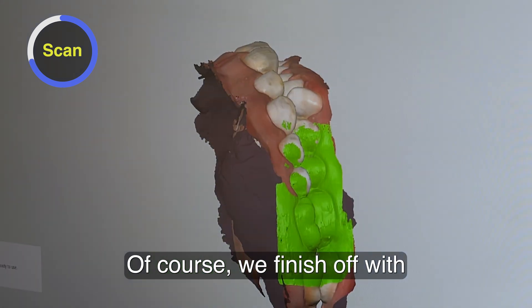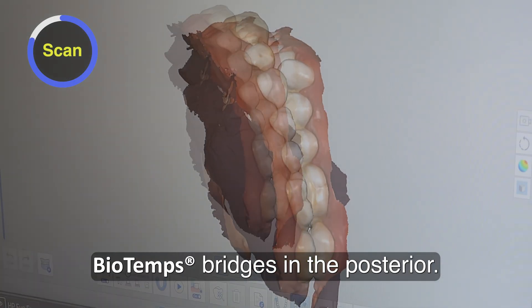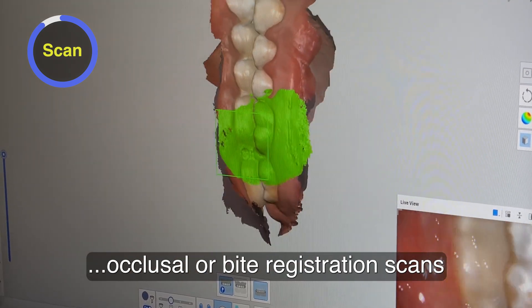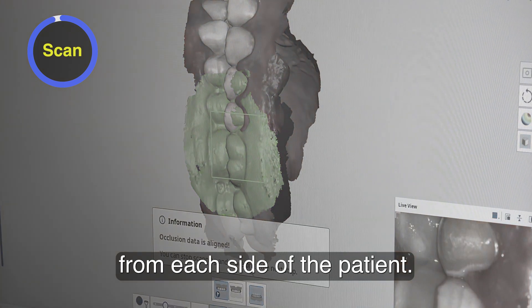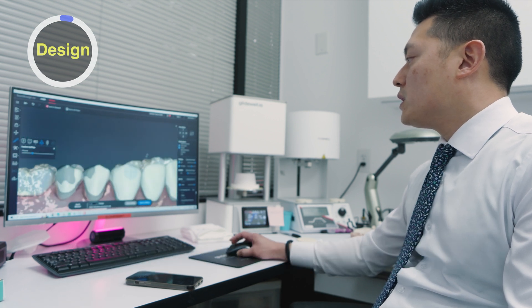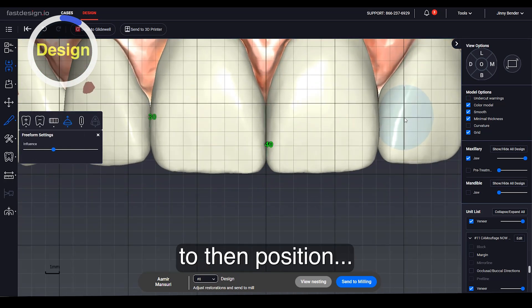We finish off with the bite scan, and the patient is at their new vertical with those biotemp bridges in the posterior. With a full arch scan, you can take a couple of different occlusal or bite registration scans from each side of the patient. Once we transfer that into our chairside design software, I'm using the pre-op scan of that chairside mock-up to then position.